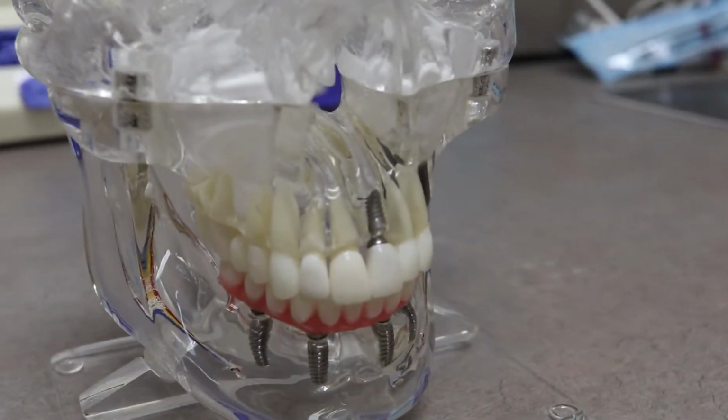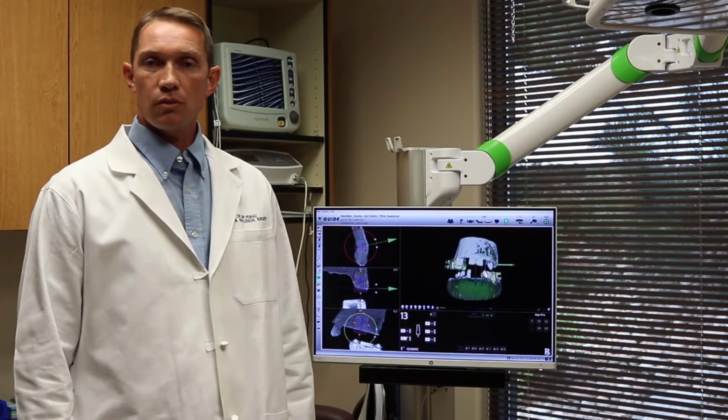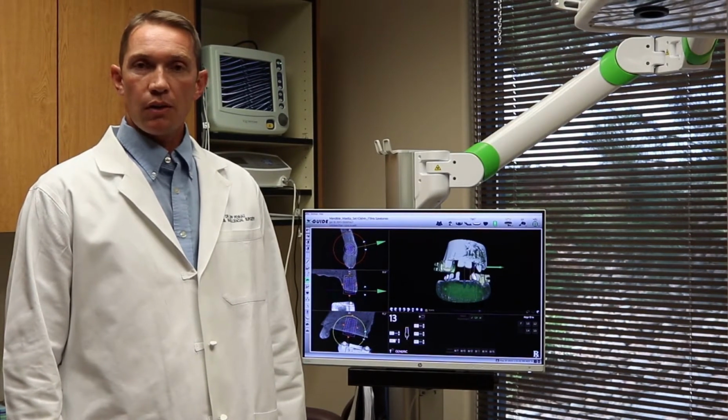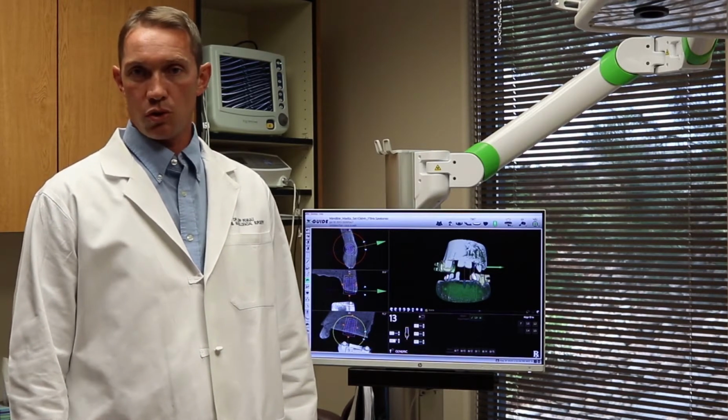Classically, what we would do was make our design on the 3D model and translate that from our imaging on the screen to our mind to the patient, and that's called freehand surgery. A couple of other options are using different kinds of guides. There's something called a static guide and a dynamic guide.